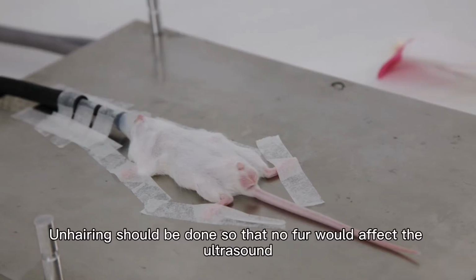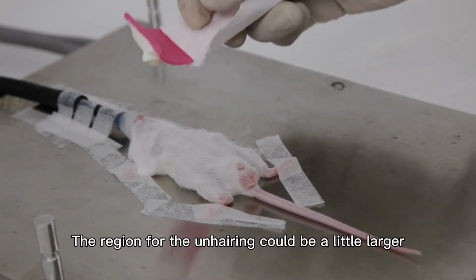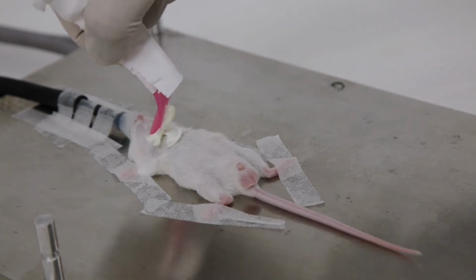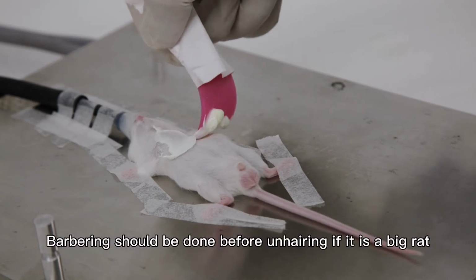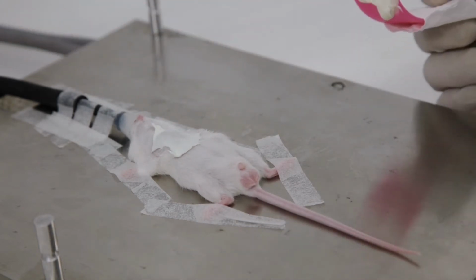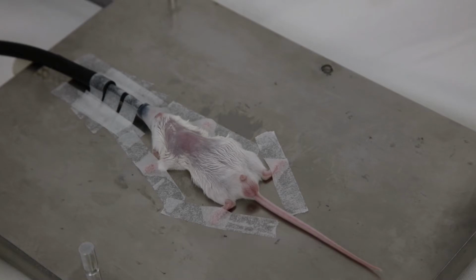Unhairing should be done so that the fur would not affect the ultrasound. The region for the unhairing could be a little larger, according to the scanning region. It is suggested to remove the tiny villi. Barbering should be done before unhairing if it is a big rat. Clean the depilatory with fresh water in order to protect the probe.